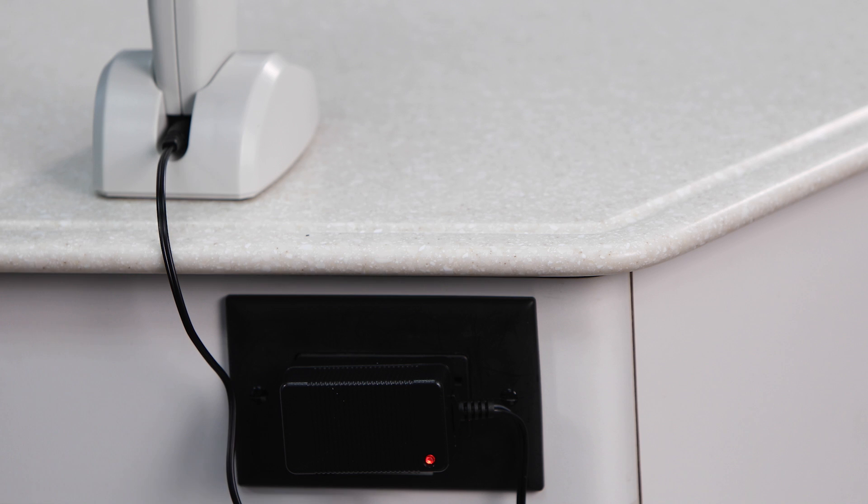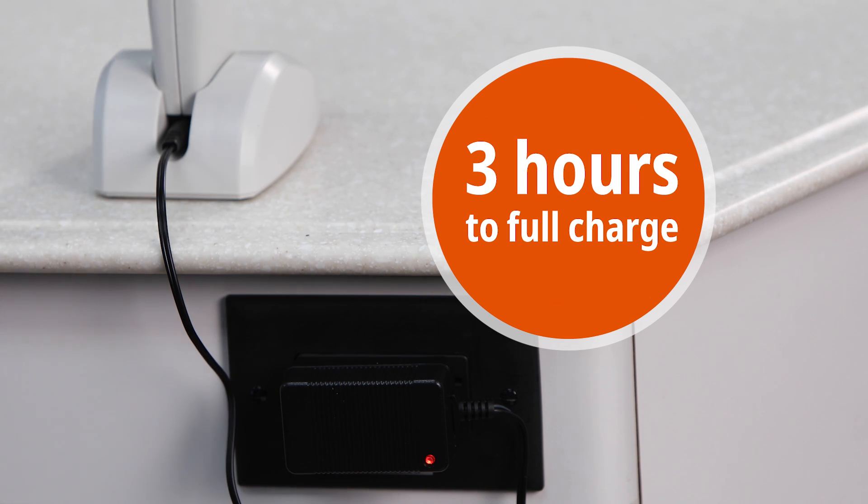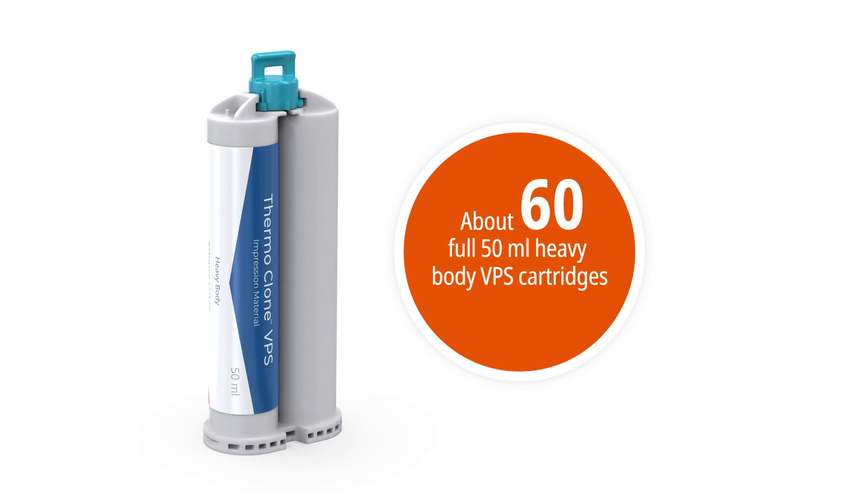Before using, charge the impression gun for 3 hours or until the LED on the battery charger turns from red to green. With a fully charged battery, the BFC3 Impression Gun can dispense about 60 full 50-milliliter heavy-body VPS cartridges.